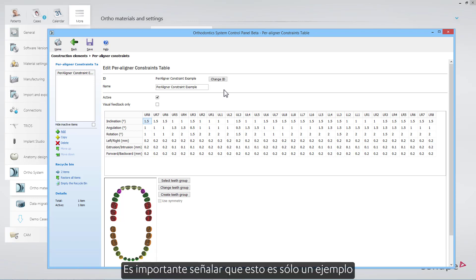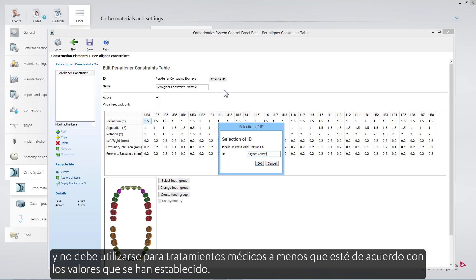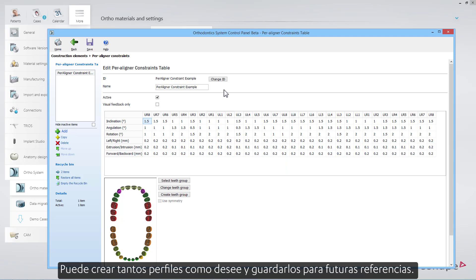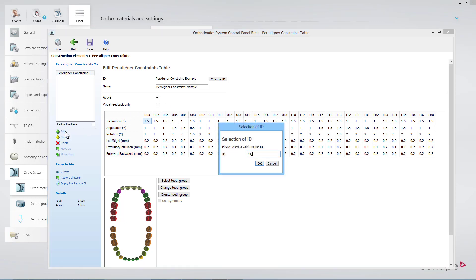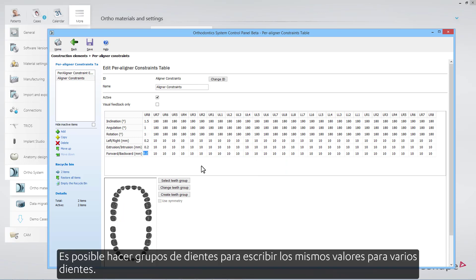It is important to point out that this is only an example and should not be used for medical treatments unless you agree with the values that have been put in. You can create as many profiles as you want and save them for future reference. It is possible to make groups of teeth to type in the same values for several teeth.